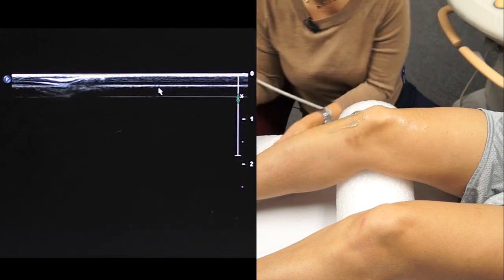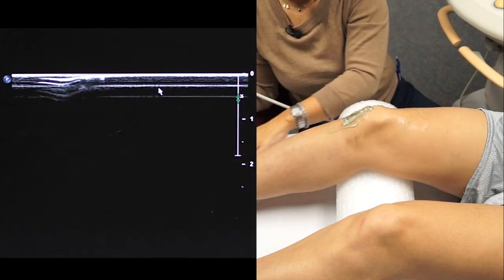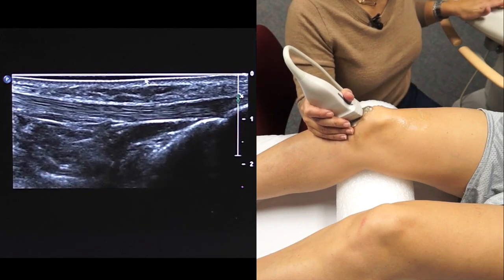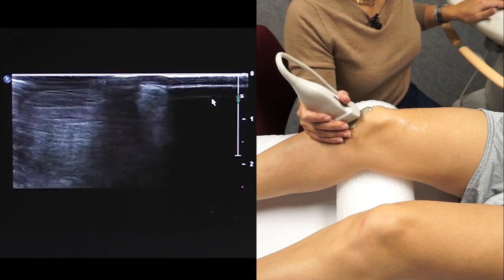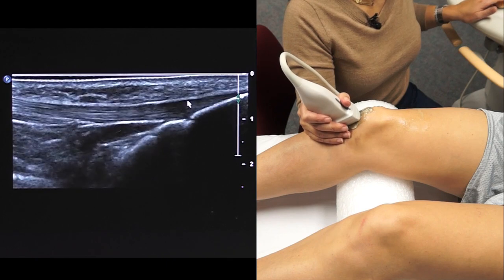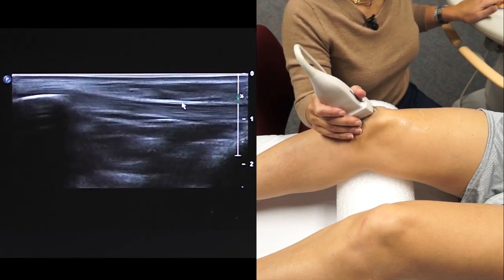So you might want to heap up the gel and scan with a light hand. See how there you can actually see the gel interface here. And so if there are any superficial bursa, you might not compress them and obliterate them from view. Okay.